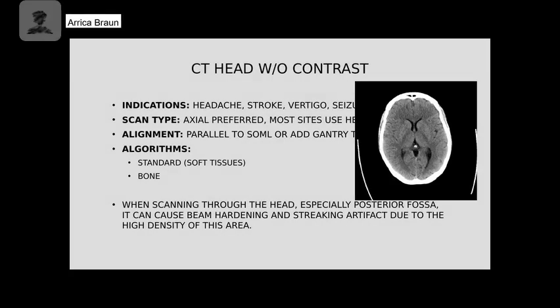For a CT head without contrast, some indications, which just means reasons that we're doing the exam. If somebody has recurring headaches or severe migraines, if they're sensing vertigo, which means when you're not moving, you feel like you're falling, somebody has seizures, and then it could be our first imaging for a stroke. We have to identify first if there's any kind of hemorrhage, because if there is, we don't want to just be immediately adding contrast. That's just adding fuel to the fire.